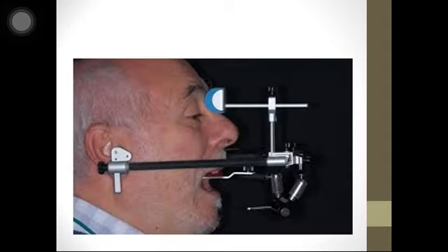These are some of the introductory pictures of face bow. Here you can see that maxilla is recorded according to the center of condyles, and it is joined together and then it is transferred to the articulator.